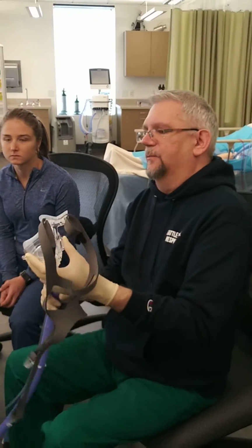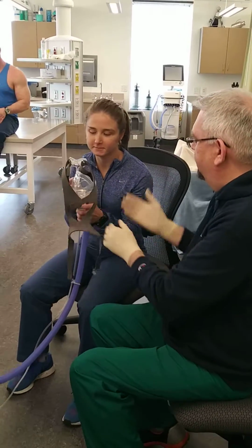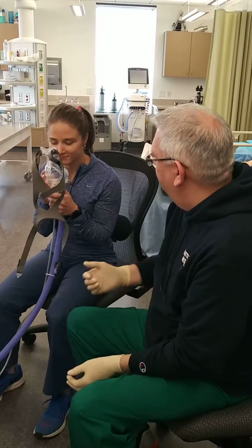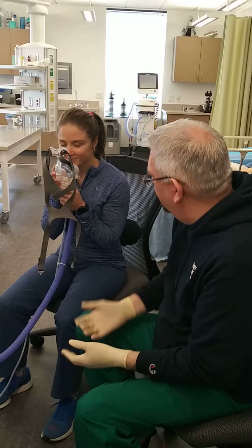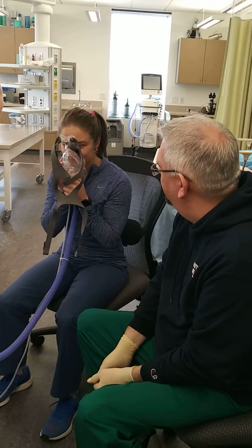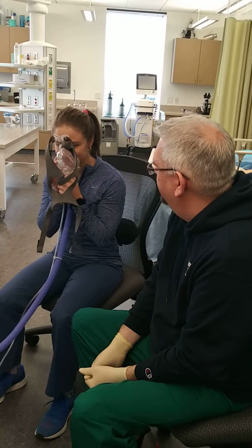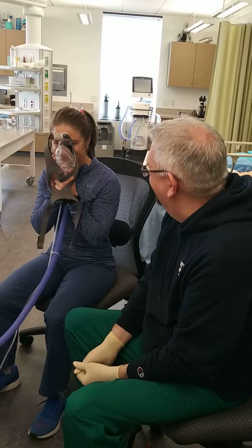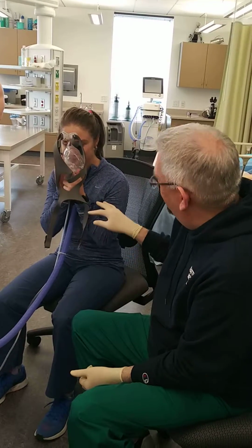So once it's hooked up and I've got some general idea about where I'm headed, I'm going to hand you this. I want you to just hold on to that. Can you tell that there's some air coming out of there? That's oxygen. That's not going to hurt you. And you can go ahead and just kind of set that in your face and take a breath. And you might notice that it's sort of pushing a little bit of air as you breathe, okay? That's what it's supposed to do. Just breathe normal. You don't have to breathe any fancy way. Just make it comfortable. Like a swimming pool. A little bit, yeah. So you just keep breathing.